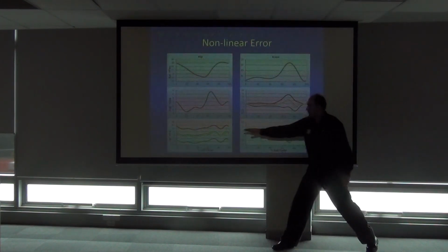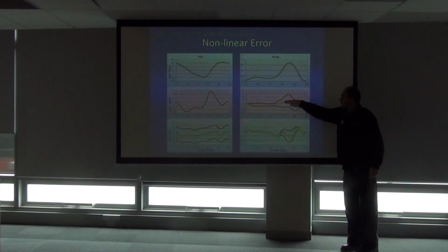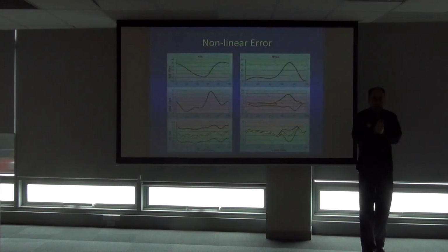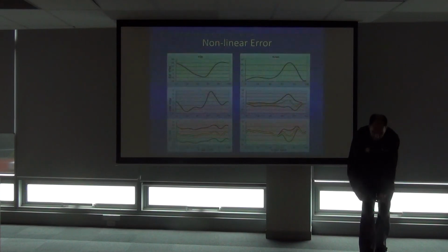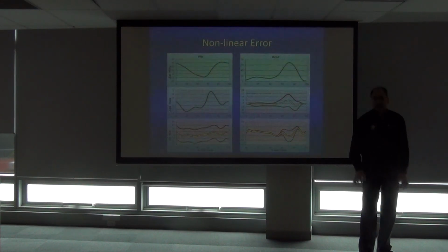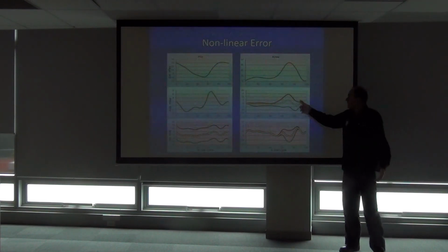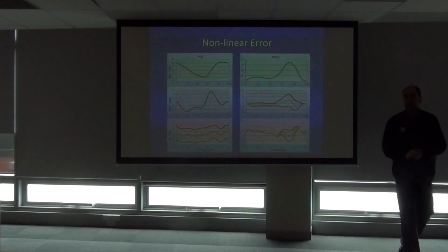This drops back down, these drop back to our original, where we had our thigh segment, our medial x-axis, the flexion extension axis of the knee, aligned best we could. It drops back to where we expected it to be.